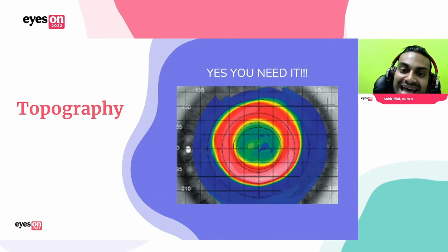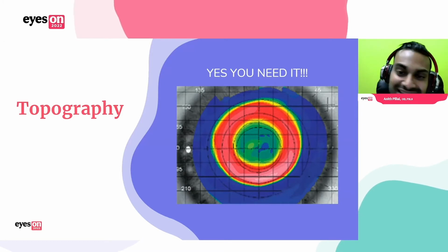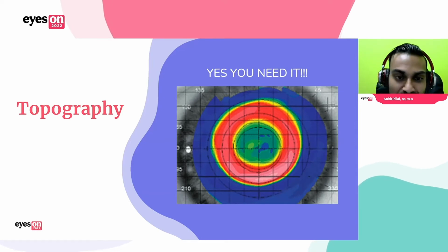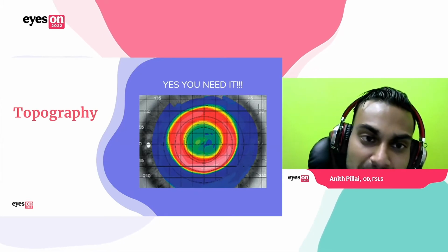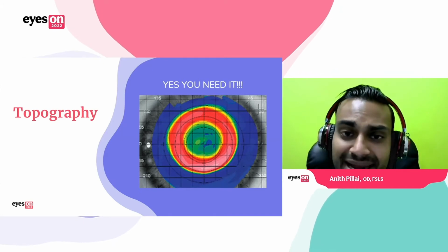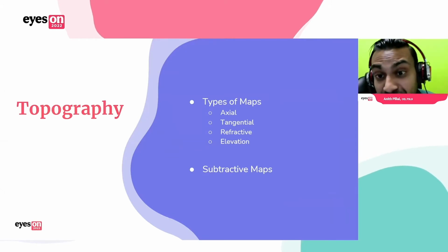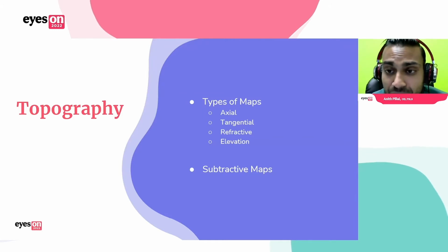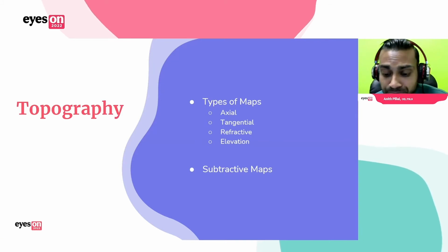So you need to know what's happening at nighttime when they're laying down with the eyes closed, because that's when the treatment's happening. And that's what the topography shows. You really have no idea what's going on without a topography. And to make modifications without these maps, it's truly, truly difficult. And I think if you're going to make the time investment and the monetary investment to really get into myopia control and having Ortho-K as part of your practice, get a topographer. There's many different maps that you're going to be using. I use every single one of these maps when I'm doing a pre-fit design or even post-Ortho-K analysis. So we're going to go into each of these maps and when to use them and why they're important.